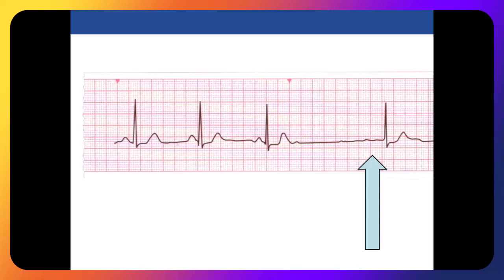If that's your P wave right there, how long is your PR interval? It's like 2 hours long. So that's why I would tell you this right here is probably artifact. Again, patient moving, maybe he's got some moisture on their skin, maybe you're monitoring the Sasquatch and you didn't get him shaved off really well or whatever.